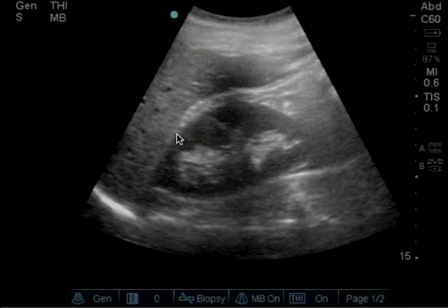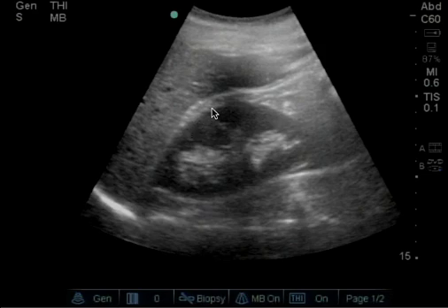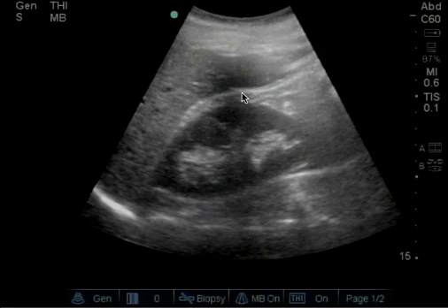Surrounding the kidney is this hyperechoic line, which is the kidney capsule. There is some perinephric fat and the peritoneum and the Gerota's fascia here.